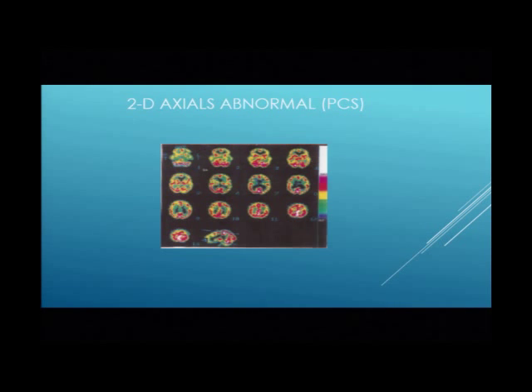And it looks like the cortical flow is interrupted. And when you look at it carefully, you can see here's red, here's green, here's red, here's yellow, and look where green is. Green is pretty low on the totem pole. That's probably about 20 or 30% flow. That's probably like a 70% reduction of flow. That's major. Anything more than a 20% decrease of flow is going to give you symptoms.